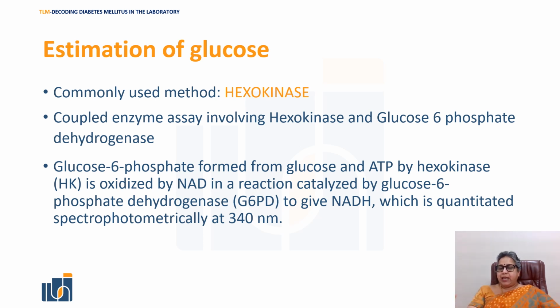So you get NADH, which is quantified spectrophotometrically at 340 nanometer. So it's a coupled enzyme assay using hexokinase and glucose 6-phosphate dehydrogenase, and you measure the end product spectrophotometrically at 340 nanometers. This is an endpoint reaction.